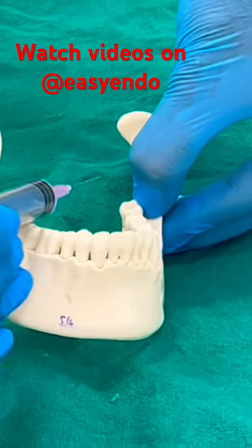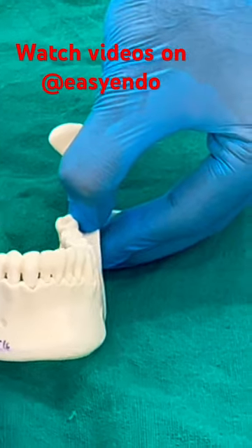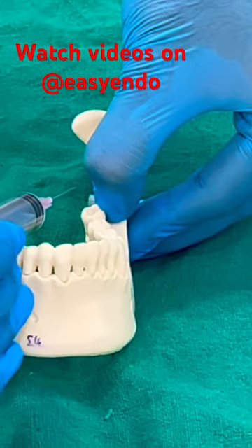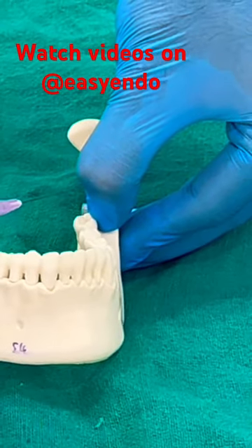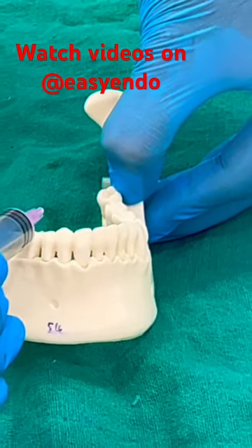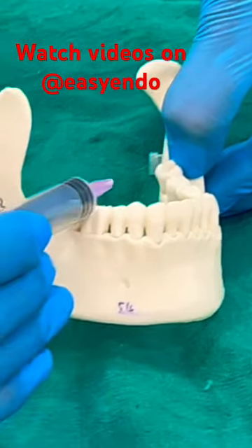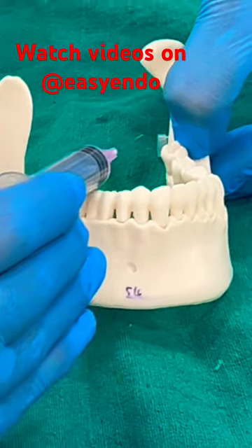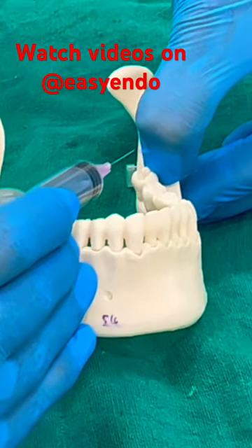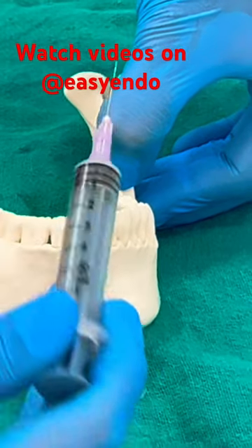Another situation that can arise is no contact. In case of no contact of the bone, you need to go a little later. I will withdraw the needle a little bit, go laterally, and then insert the needle again. Then you should be able to contact the bone.